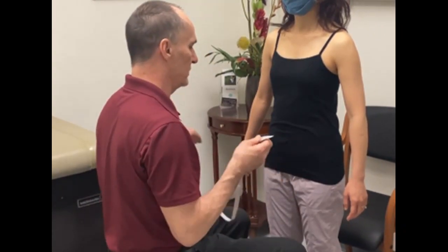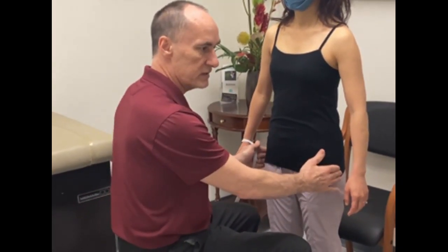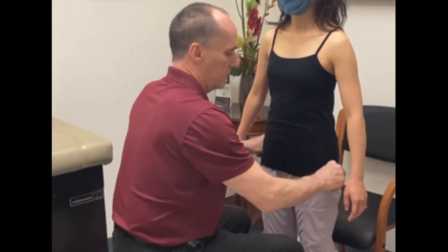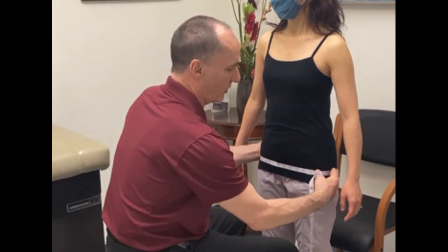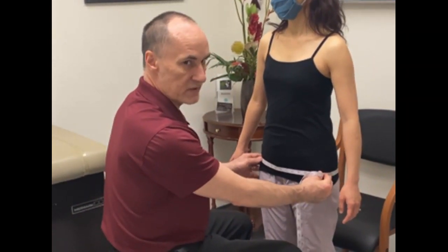Take the measurements at the greater trochanter level, just wrapping the tape around and letting it rest against the body with minimal tension.